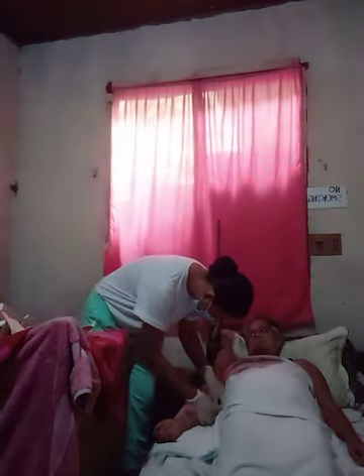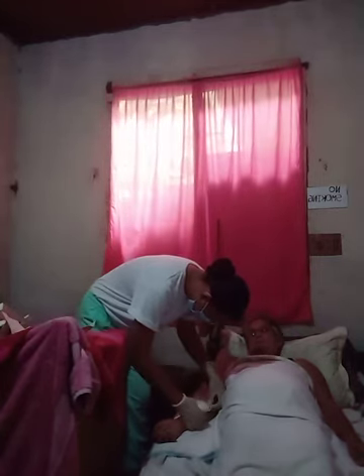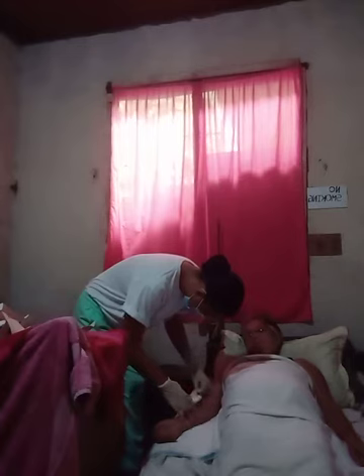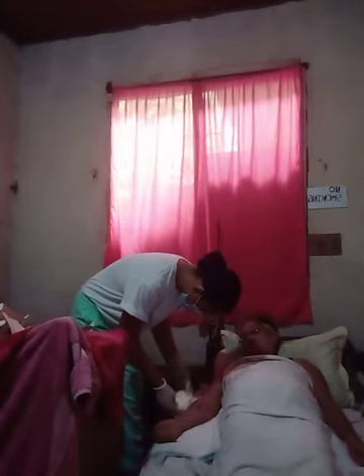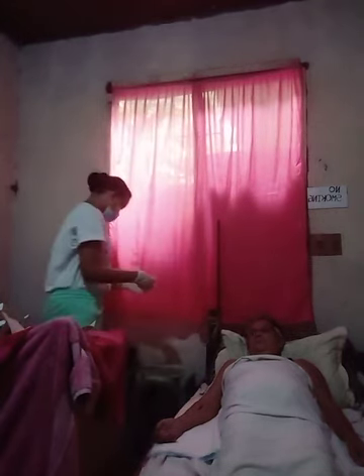Remove this. So, inspect. Okay. Then put it in a waste receptacle.